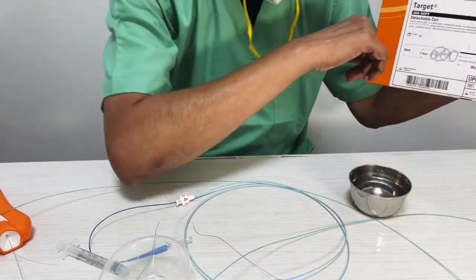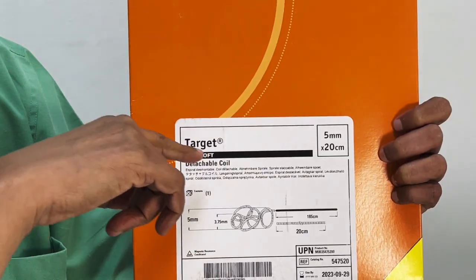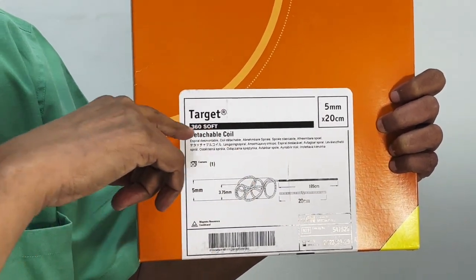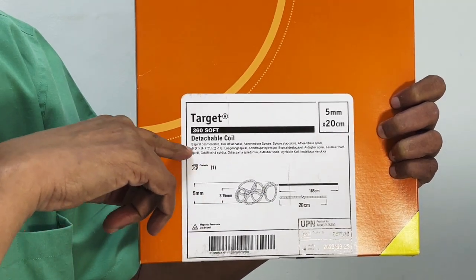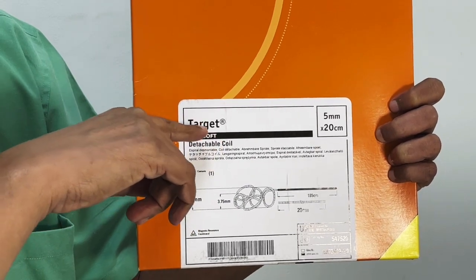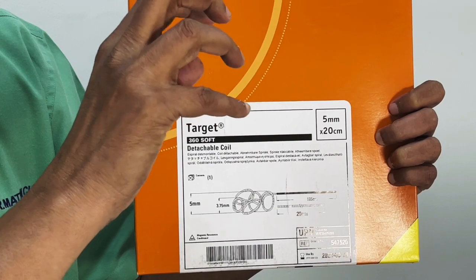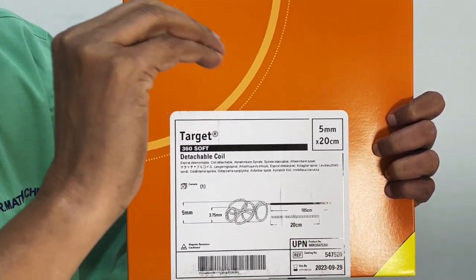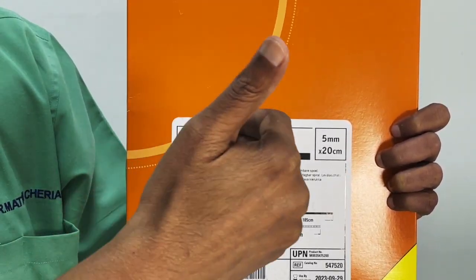For example, let's understand this well. It is a coil made by a company called Target. It is a 360 coil because the shape is complex. It is a detachable coil because it's electrically detached. It is a soft coil because you've got a standard coil, you've got a soft coil, you've got an ultra soft coil. So basically, what does it mean? How much pressure is required to make the coil fold? That's basically what is meant by standard or soft or ultra soft.